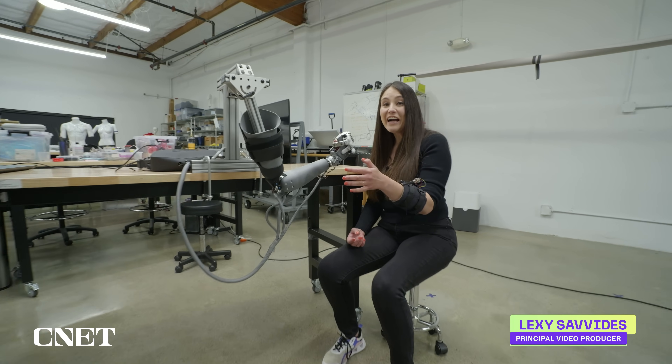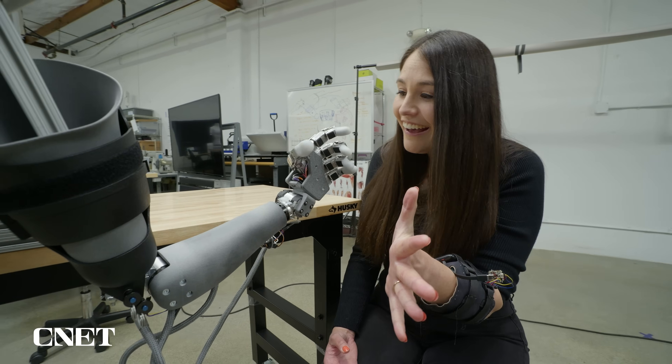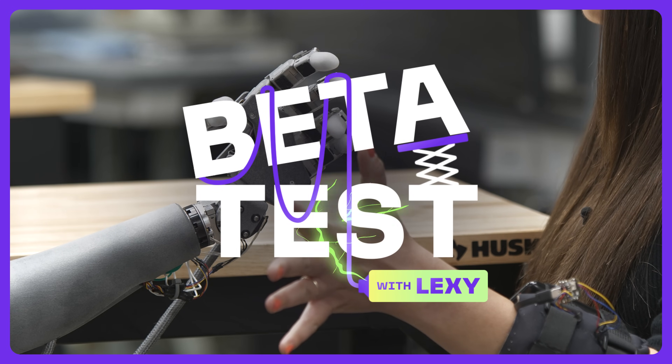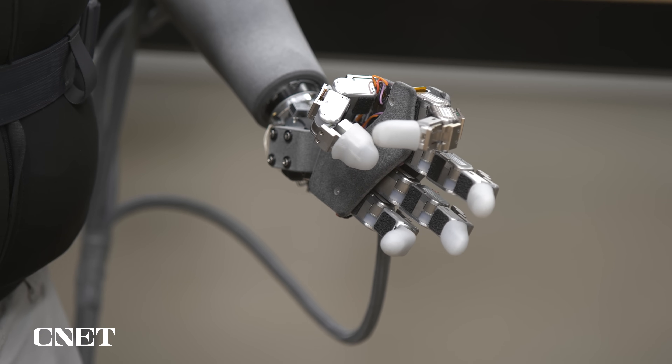This is Atom Touch. It's a prosthetic arm that you use your mind and muscles to control. Let me show you how it works. This artificial arm is completely non-invasive, and it's the world's first prosthetic to have individual finger control. You can control every joint.